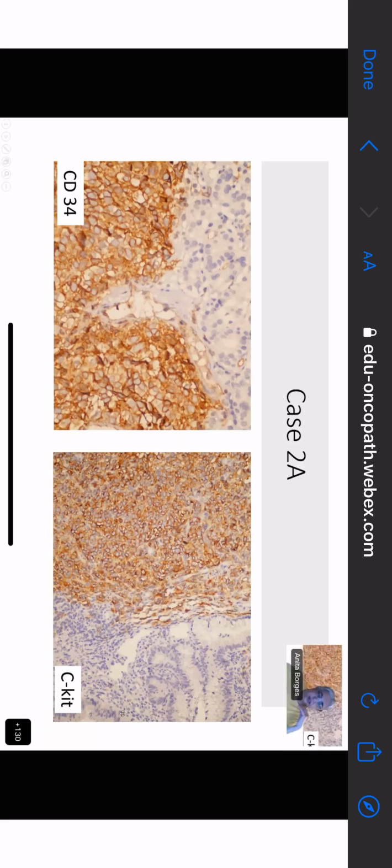Oh, okay. What is it? Is it visible now? Yes, ma'am. What is it? C-kit is positive, ma'am. What is that? C-kit. What is C-kit? It is also known as CD117. What is that? No, ma'am. You don't know, Suveta. Will somebody like to tell her, Limpy, what is C-kit, CD117? Marker for GIST. It's a marker for gastrointestinal stromal tumor.